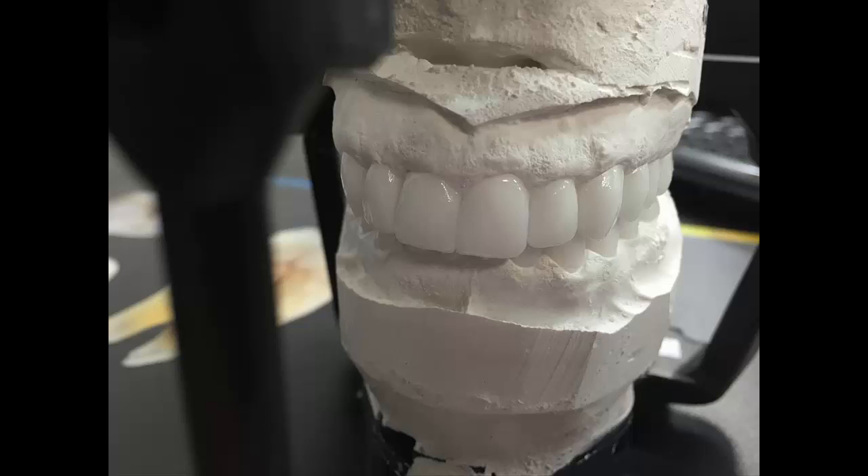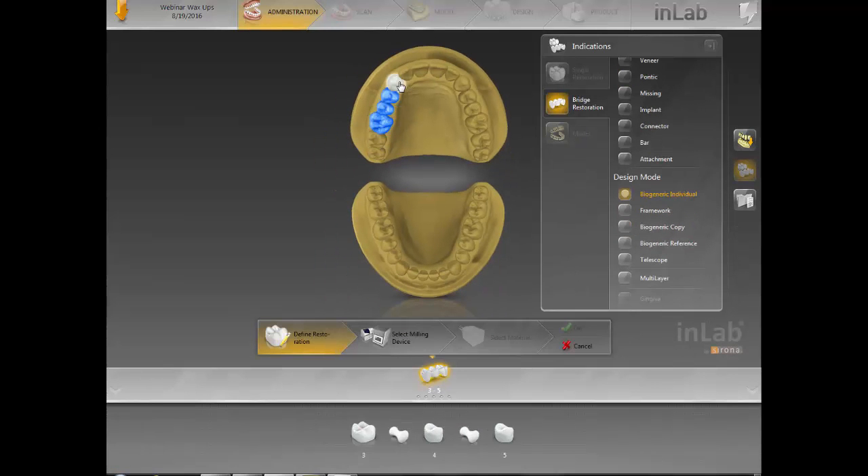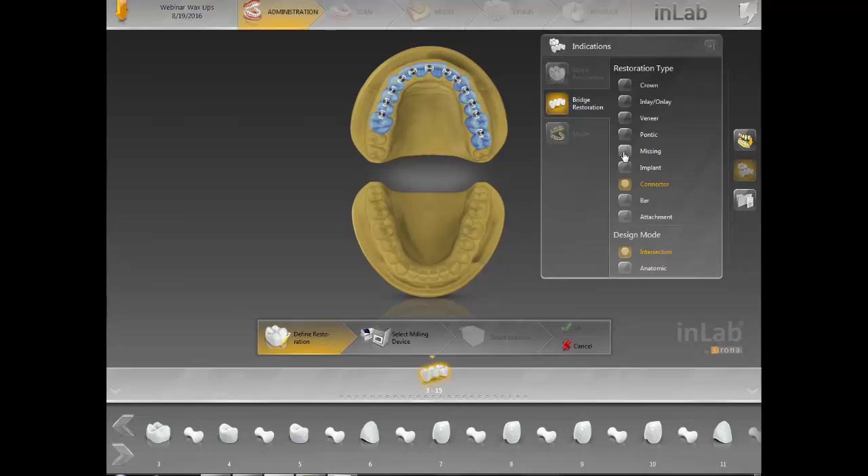I want to show the process after everything is scanned and prepped. What we're going to do is click on bridge restorations. I prefer to do them as a bridge instead of single units sometimes. If I want to show some really nice embrasures and I don't want to work on the case too much, I'll use single units instead of a bridge. When doing a bridge, the connectors I choose are always intersection — it looks nicer when it mills out and is a lot easier to handle.